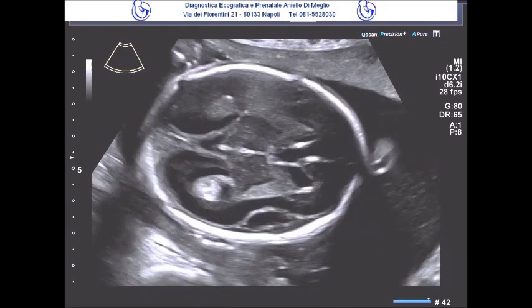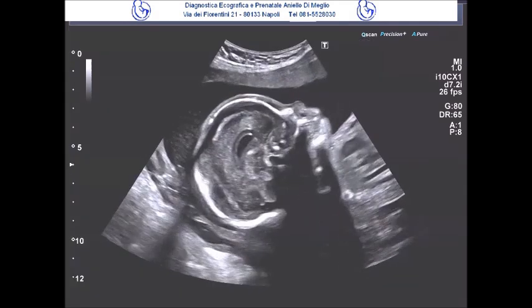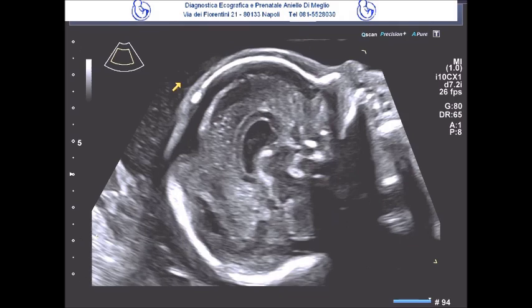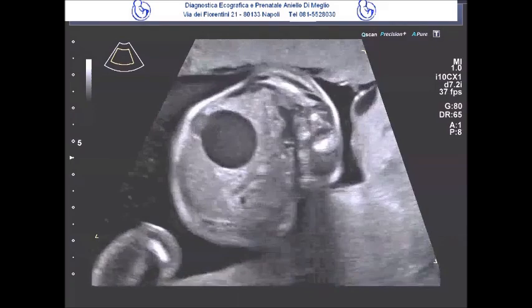The cranial biometry is also normal and corresponds to the gestational age. Similarly, in the sagittal view, we see a normal corpus callosum. The fetal profile is also normal. Moving on to the scan of the abdominal area, we see the bladder on a higher abdominal plane.